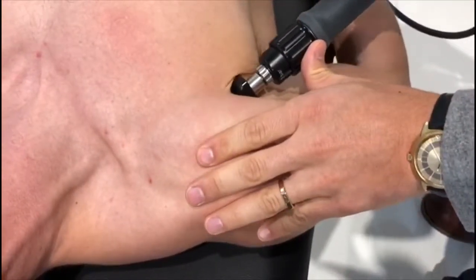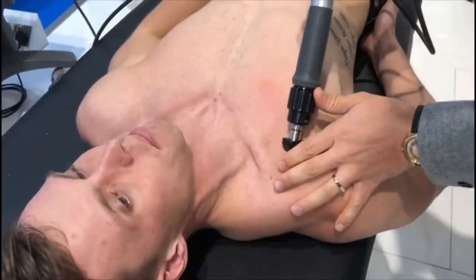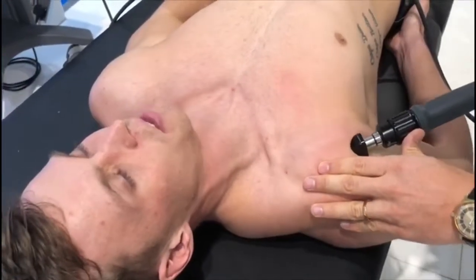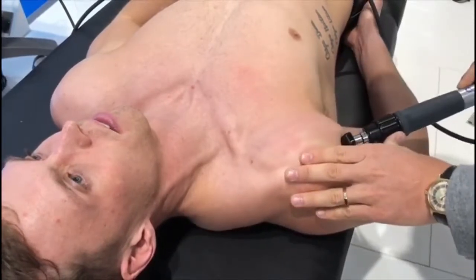So how does this feel compared to the posterior part? Similar. That feels like a good one. You can see on your skin here that it's a little bit tight.